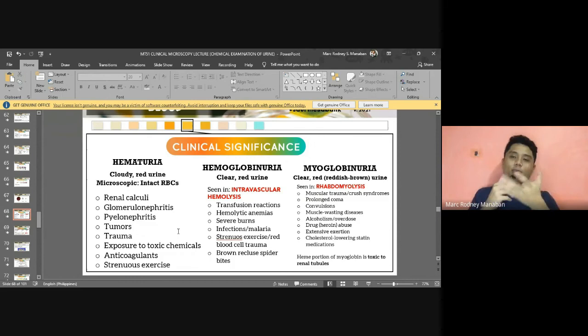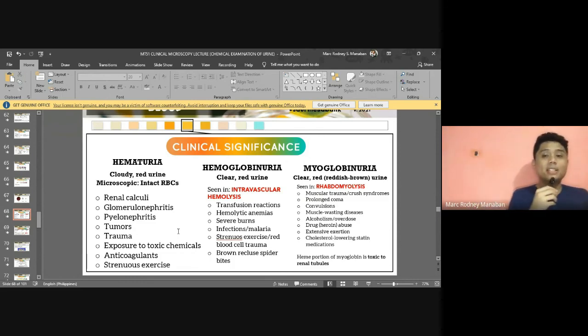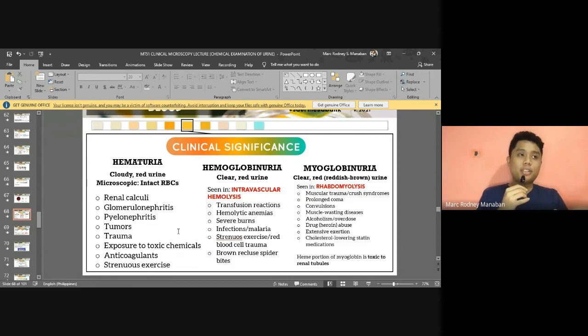Pero as I've read, no, para dyan ma-settle nato siya, according to Brunzel, of course, hemoglobinuria, hematuria, dears, same siya sa concept na microscopic hematuria. If the amount is just little pa lang yun, alright? Hemoglobin can be found in your urine, or your RBCs can also be found in your urine in amounts pa lang na little to the point na dili pa sila makitaan na macroscopically. Like, dili pag yun makita na na-change sa color, na-change sa clarity, alright, in terms of hematuria or hemoglobinuria. Pero they are there, no? Naagit sa ihi, pero in low concentration pala. So I think mo to yung point sa Strasinger katong letter A. Mo to siyang iyang gichakto ang answer.